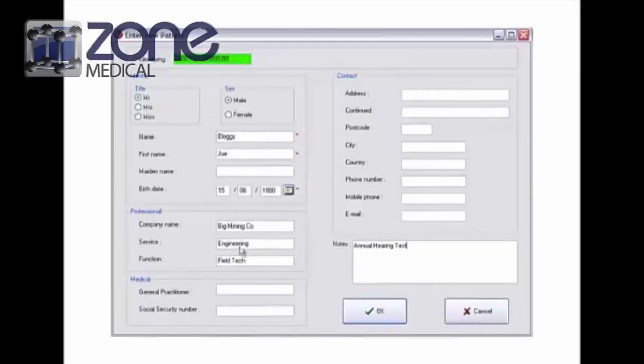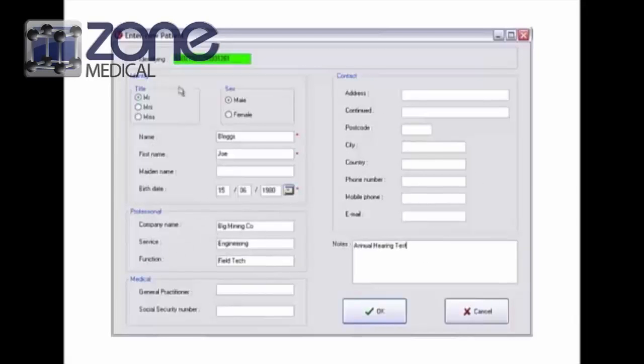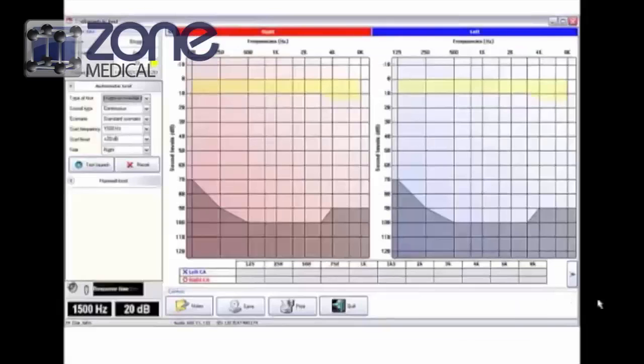There are optional fields, so it's up to you depending on how much information you'd like to give. You can indicate that it's an annual hearing test. Once you've entered the information, click OK and it'll take you to a test.